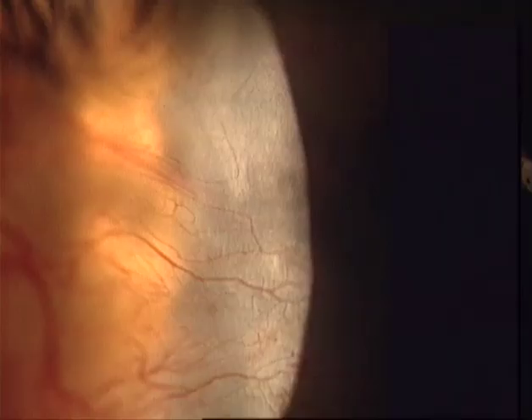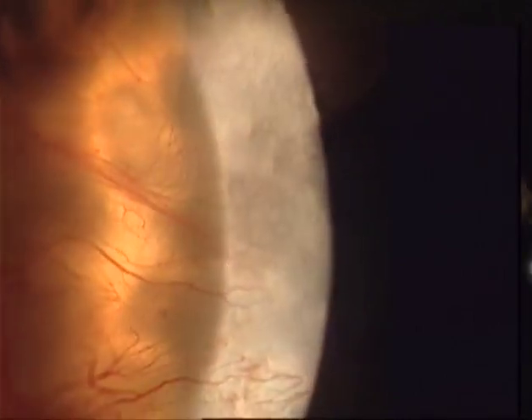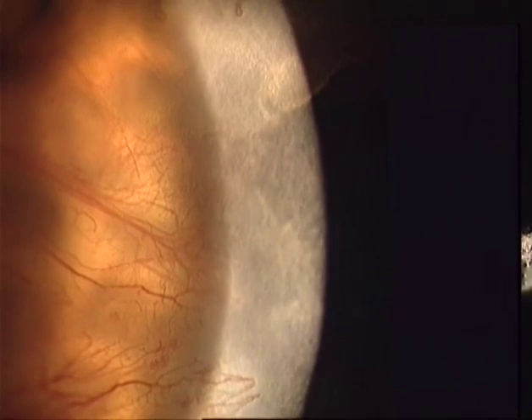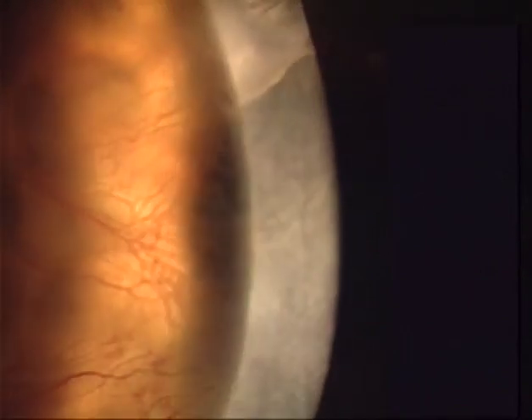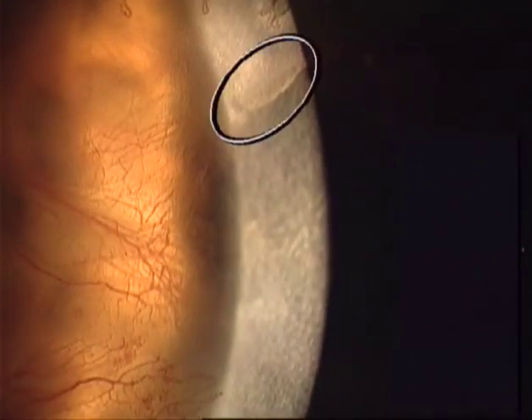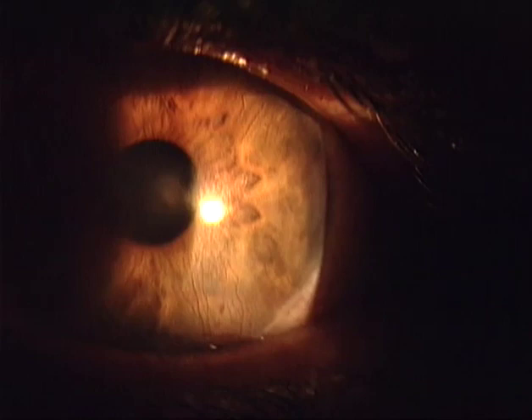With a large illumination angle, by shifting the slit lamp laterally, the illuminated background is brought behind the target. Now in backlight, the vessels buried deep in the corneal stroma can be seen in detail beneath the superficial vessels. The direct light reveals the haziness of the corneal stroma and even an overgrowth of conjunctival epithelium with a sharp margin. Note that narrowing the light beam effectively improves the separation of illumination modes.